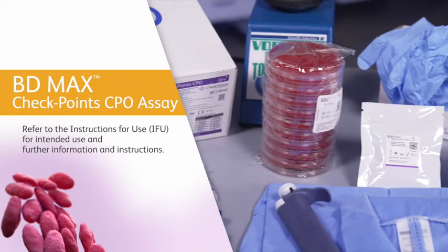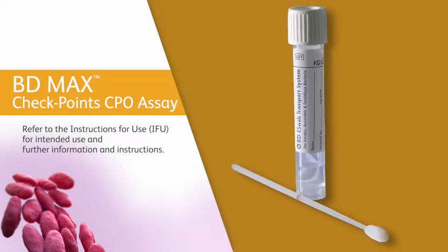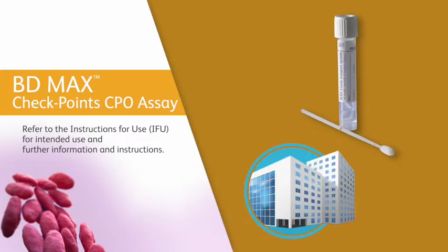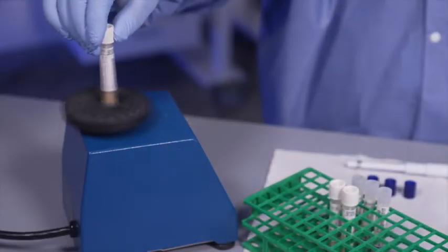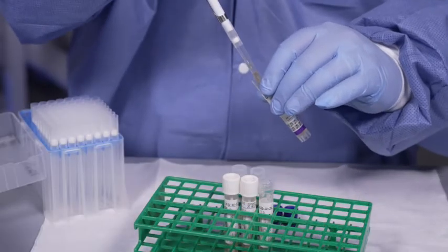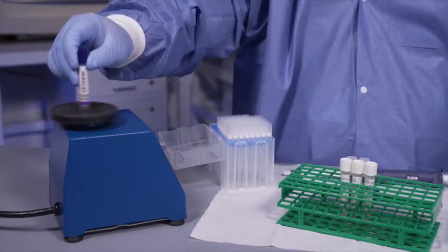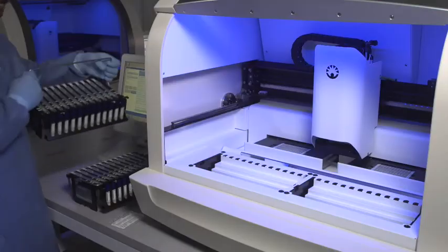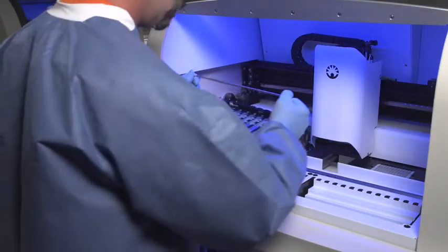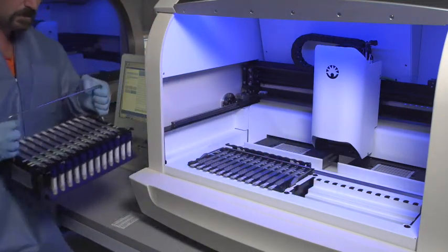Let's get started. The BDMAX Checkpoints CPO assay performed on the BDMAX system requires a rectal swab specimen to be collected and transported to the laboratory using the e-swab recommended in the instructions for use. An aliquot of vortexed rectal e-swab media is placed in a BDMAX Checkpoints CPO assay sample buffer tube. The sample buffer tube is once again vortexed, and the tube is then placed into the BDMAX system rack. The BDMAX system is loaded with BDMAX racks containing prepared sample buffer tubes, assembled unitized reagent strips, and PCR cartridges.